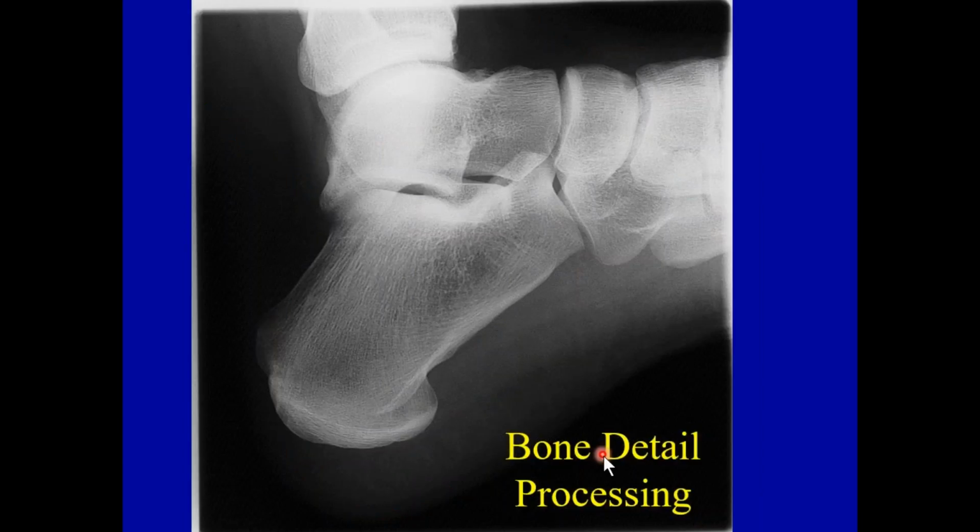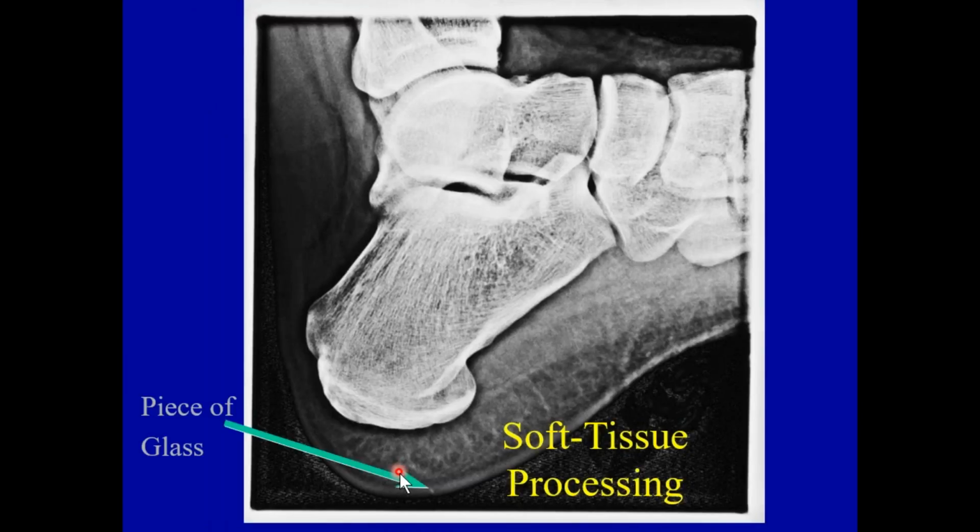Now again, if your digital system has the capability, or the doctor spends the money on software that will enhance things, so now the question is, which is better? Well, on soft tissue processing, which is a software enhancement, the patient was having heel pain, not because of the heel, but because of this, where the green arrow is obviously where the glass became embedded. If it's a small piece of glass, it simply becomes walled off with scar tissue, but every time you put pressure on it, it hurts.